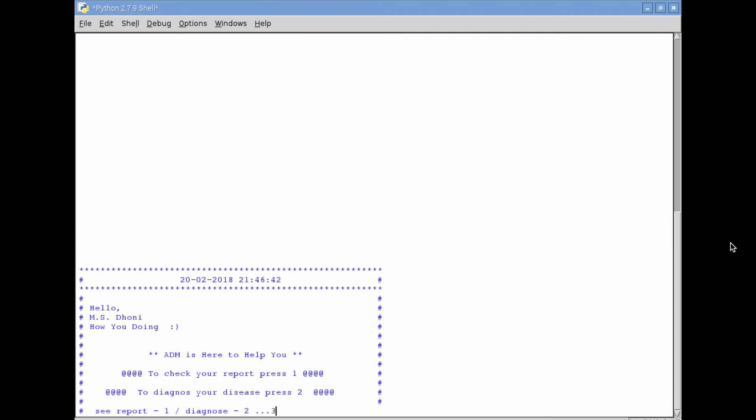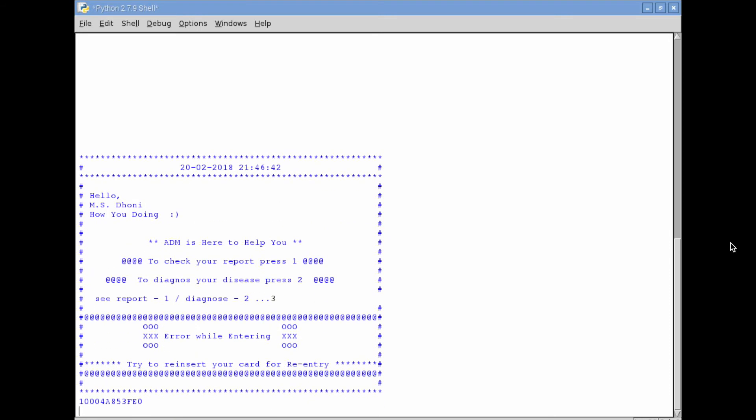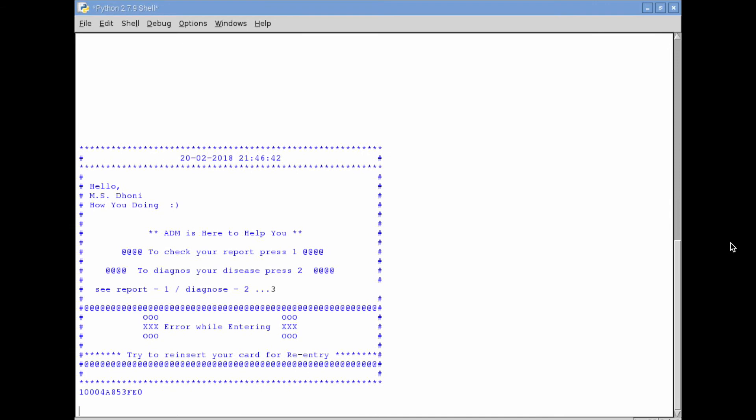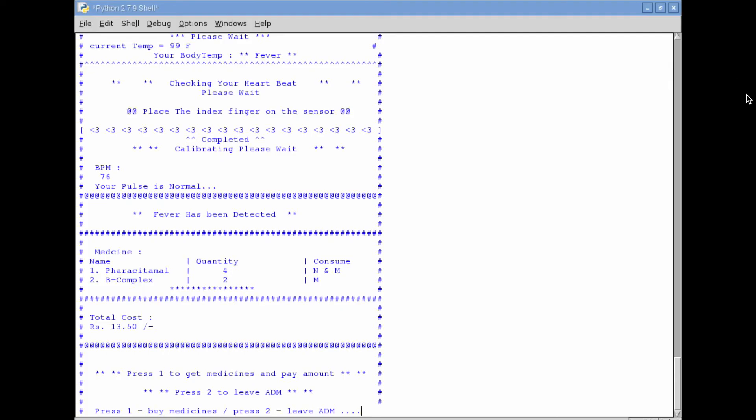So, you can see that I'm just getting into case two where I enter number three. Number three is not an option. Number one is an option for report, number two is an option for diagnostics. Whereas when you press number three it won't work.